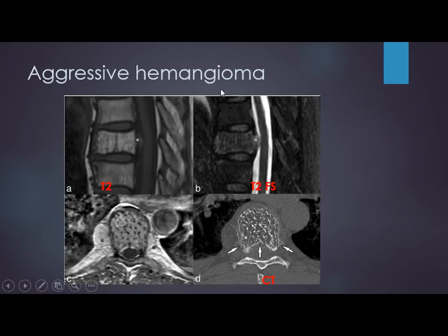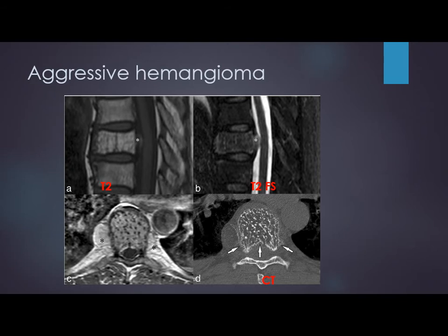Aggressive hemangioma on T2 fat saturation and on MRI shows polka dot appearance, as does CT. On CT you can clearly see the soft tissue extension of the hemangioma.